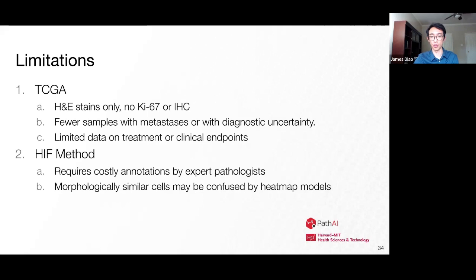But that's one limitation, is that oftentimes the class will not actually represent just the class itself, but rather a broader set of cells that are primarily that class, like primarily fibroblasts, but still have leakage from other things that kind of look like fibroblasts in the right setting.